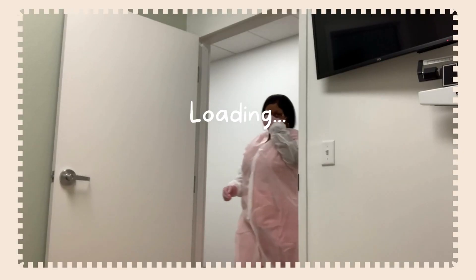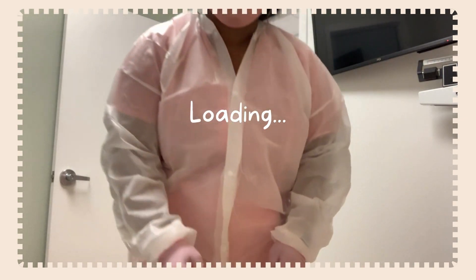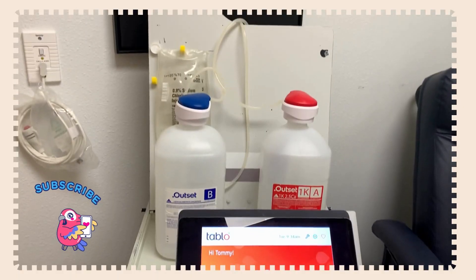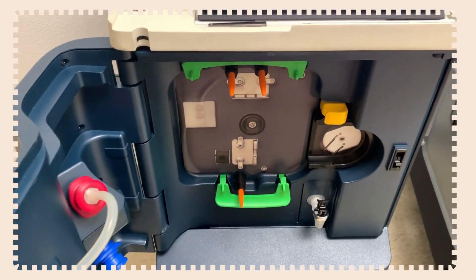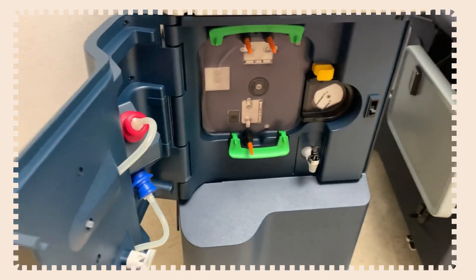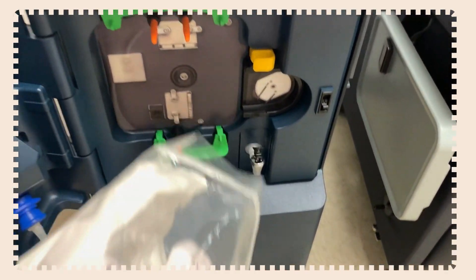Welcome to Your Dialysis Nurse, where we talk about everything dialysis and kidney related. I'm Nicole. Today I'm going to walk you through the setup of the Tablo machine. This is an at-home hemodialysis machine, and it's fairly new to the market. What I love about it is it walks you through each step.